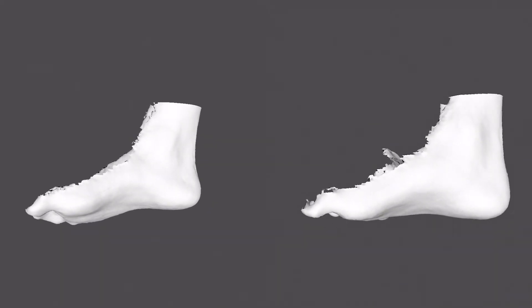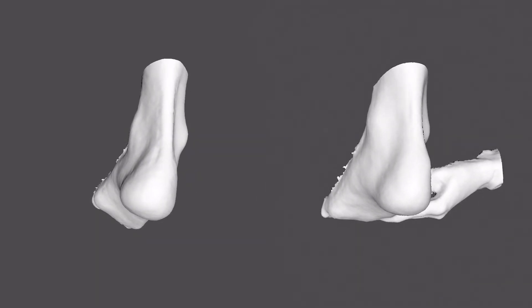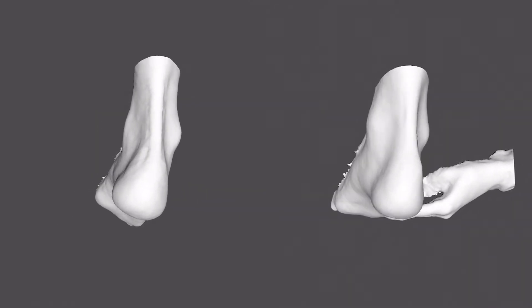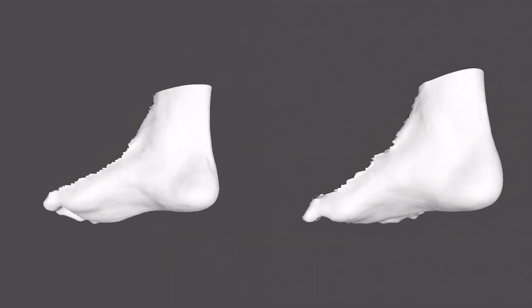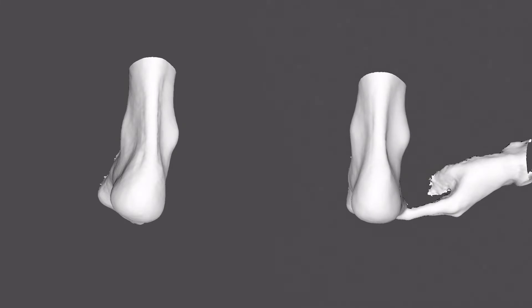The left-hand cast, where the foot was not positioned, captures a curvature of the lateral border, which means the mid-tarsal joint is supinated. If we make a foot orthosis from this supinated cast, the orthosis will be uncomfortable and will not function properly because it will tend to supinate the foot at the mid-tarsal joint. The right-hand cast has been taken in a proper position where the mid-tarsal joint is fully pronated — locked and stable — and the lateral border of the cast is straight. So the right-hand cast is going to lead to a comfortable orthosis and a much better treatment outcome.